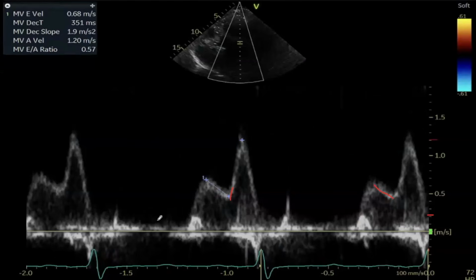However, they will give you hints that the LA pressure is elevated. This is the maximum you can say sometimes. I would write: Doppler signs are suggestive of elevated LA pressure. This patient can go for further evaluation. I cannot tell from just a few signals.